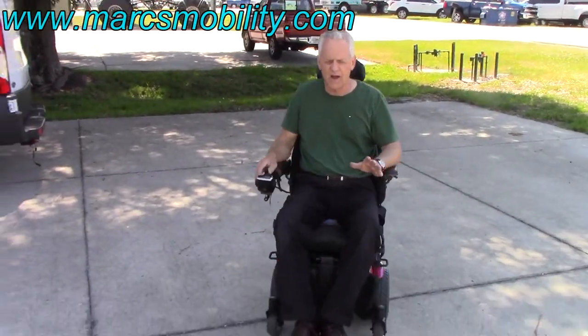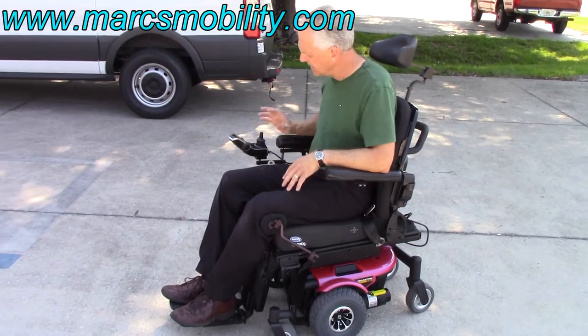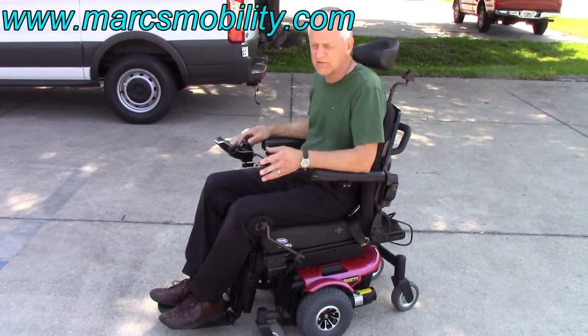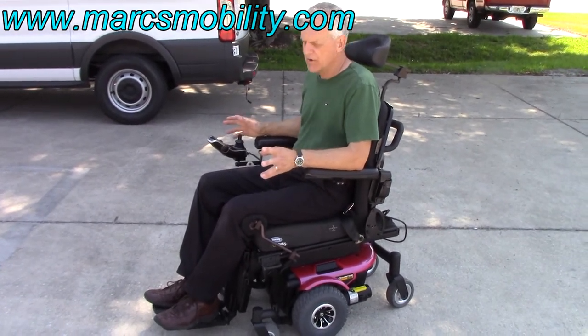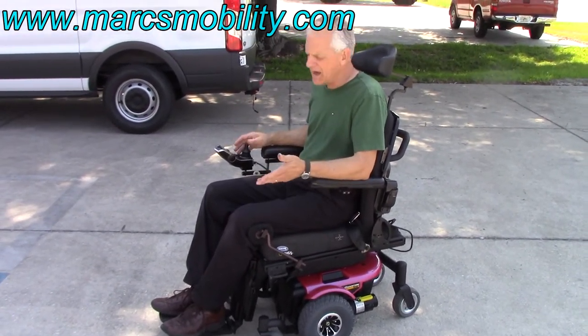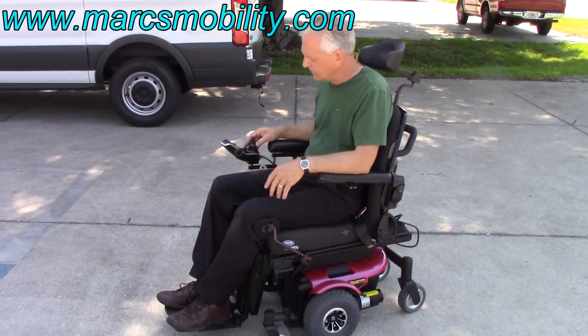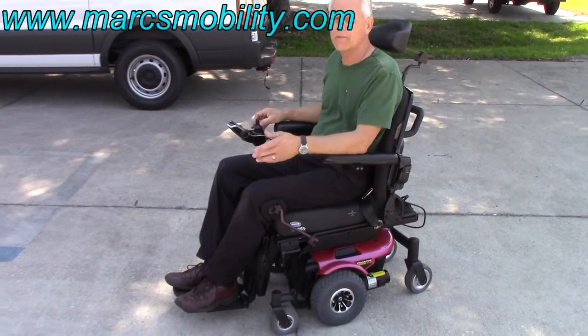This chair is so easy to drive — it responds very easily. So if you have someone who's a little skittish, this one is really easy to drive. It doesn't do anything fast; it does everything slow. Four miles an hour is top speed, so it's not a fast chair. But you can go inside and outside with this chair. It has the 10-inch seat lift, the tilt, and the electric leg. It's a great chair, and it's very quiet.